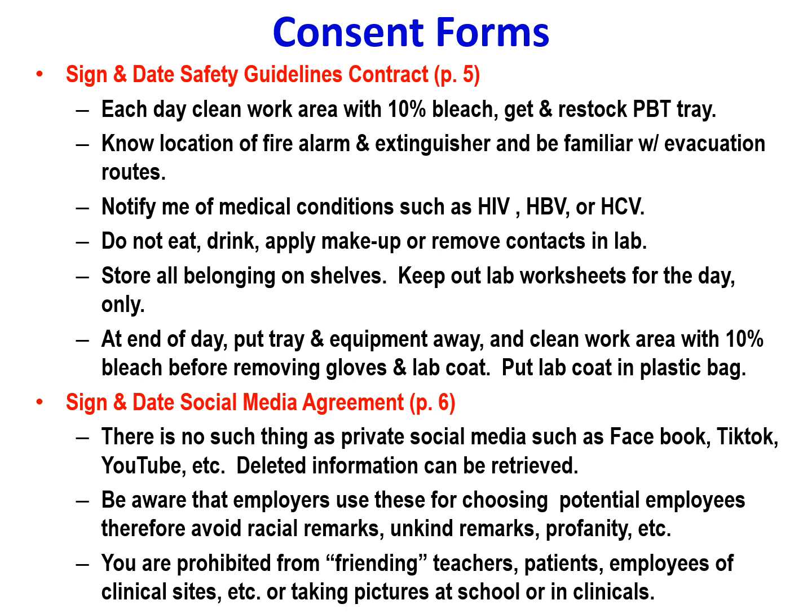We also talk about how at the end of each and every day, you will put your tray and your equipment exactly back where it belongs, clean your work area with 10% bleach, and remove your gloves and your lab coat before leaving the lab. And we will go over the difference between your cloth lab coat that you wear to meetings and when you're outside the lab, and the impermeable paper style gown or lab coat that protects you from blood and body fluids when you're performing venipuncture or doing any type of CLIA waived testing in the lab.